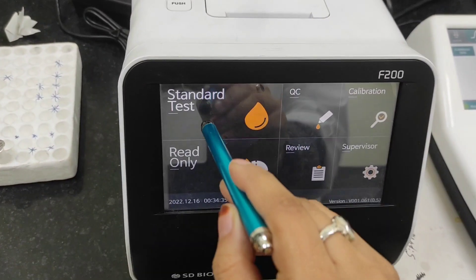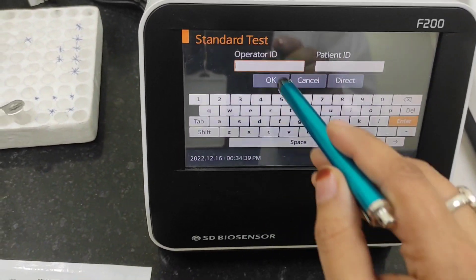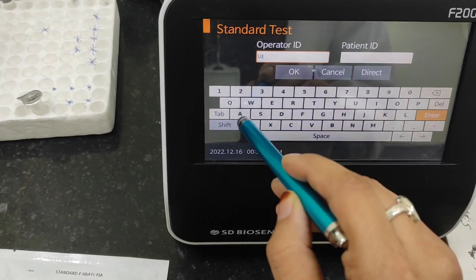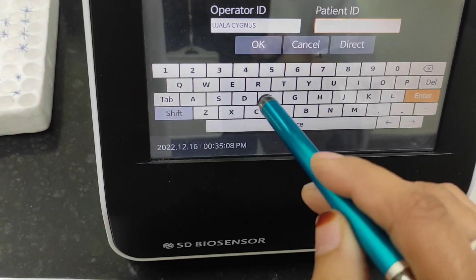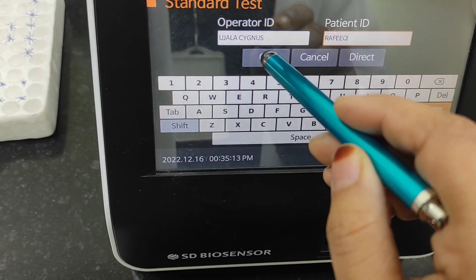Now starting the test. We have to insert the operator ID, whatever the ID is, and after that we will insert the patient ID and select OK.